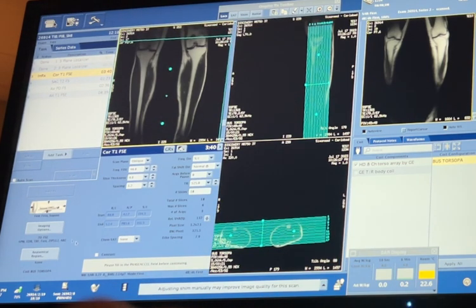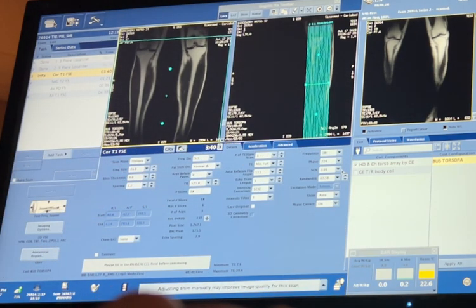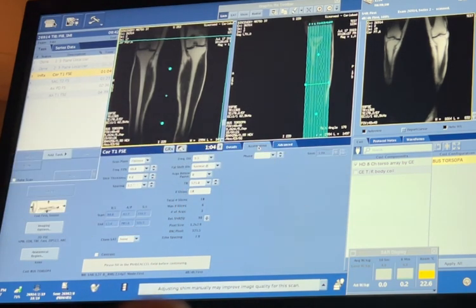And then we can, let's click this, and let's drop the NEX to 1, and the phase to, you can? Yeah, 160. Let's just do that, save, alright. And then we have to do the acceleration, crap. Try to put that on 1, save.